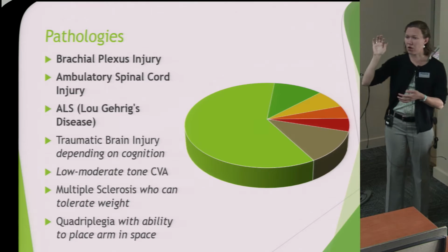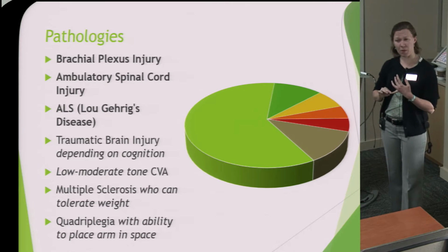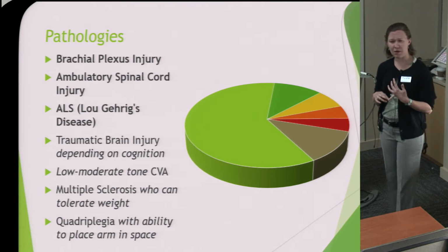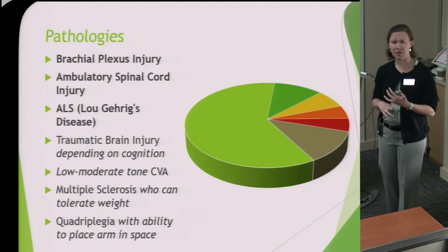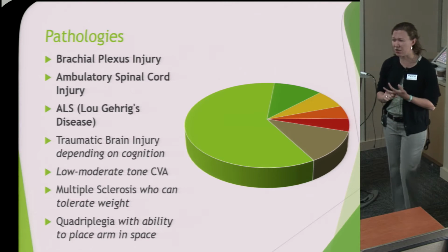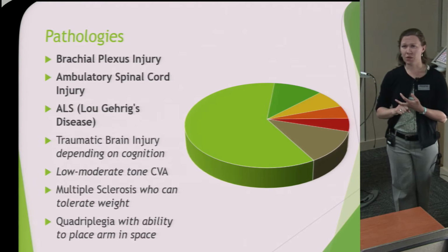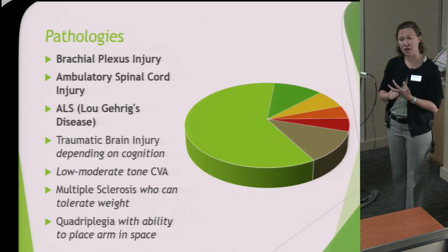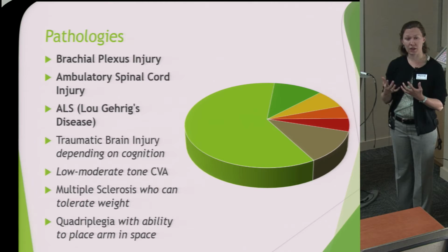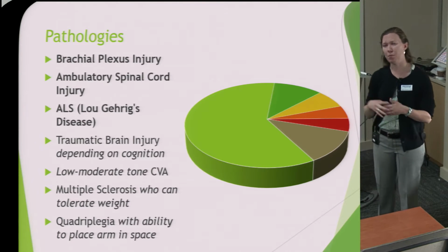But kind of our gold star patients, the ones who really do well with this, are those with brachial plexus injury or some other pathology that mimics a brachial plexus injury, maybe radiation or something like that, which has caused a plexopathy of some sort. An ambulatory spinal cord injury patient with an incomplete injury, usually around C4, C5. Those patients do very, very well. Along with the brachial plexus injury patients, most of those spinal cord injury patients do have some residual hand motion. So they really do very well getting more independent and more functional once they have use of that arm back.